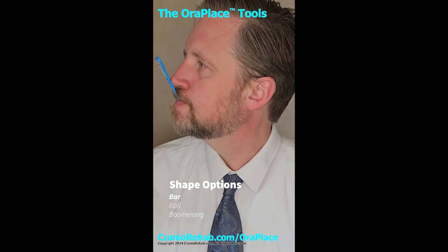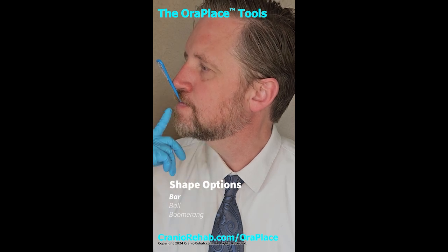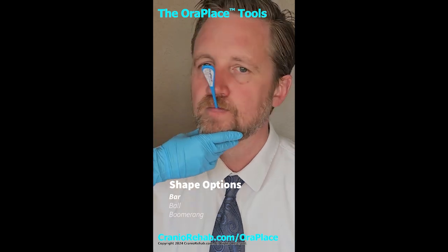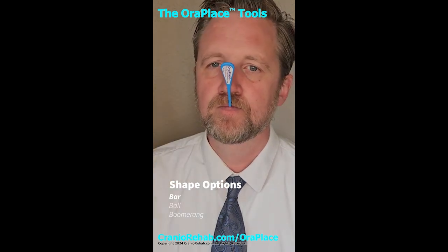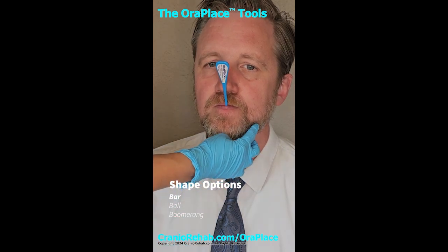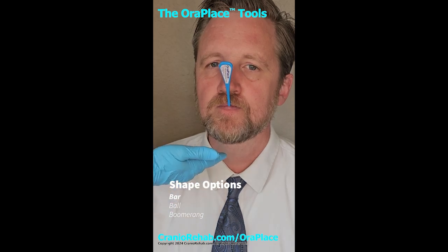Now this is important to think about when you use these tools. Even when stretching down through here with the bar-shaped tool, it is also slowly impacting the platysma. The platysma muscle is a muscle of the neck that inserts right about here. By stretching these muscles, you're pulling the platysma up, and you're going to see secondary effects down below the chin.